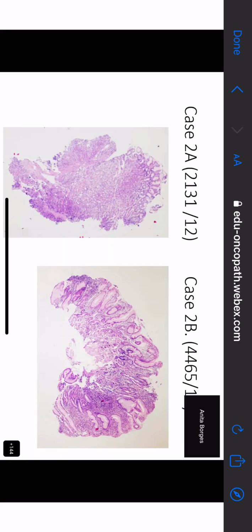Yes, Shweta, how do you know? Ma'am, the foveolar epithelium and the glands, the foveolae predominate over the glands. The foveolae are longer than the glands. Yes, ma'am. Is that what you're saying? Shweta, are you hearing yourself speak? You're calling this gastric body mucosa and you're telling me that the foveolae are long.